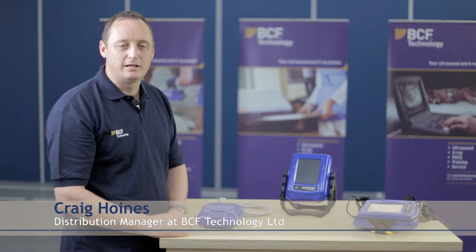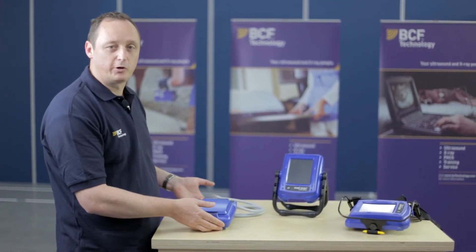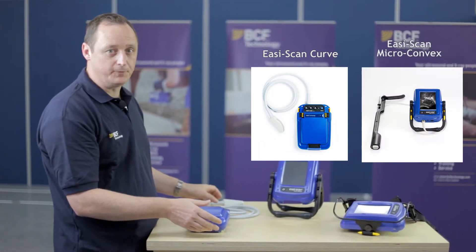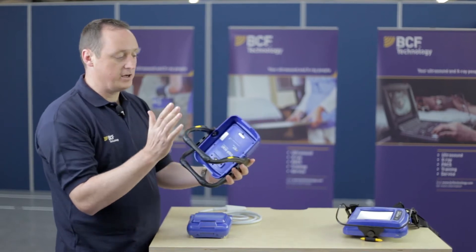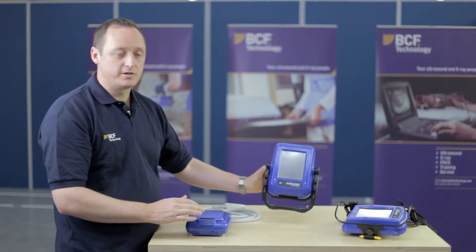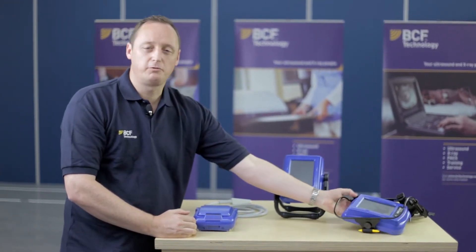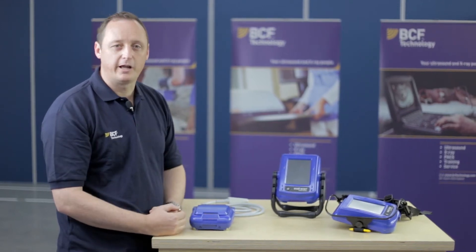Looking at the smart display and how this works together with the EasyScan. We have the EasyScan product, which could be the linear, the curve, or the micro-convex probe option. It works with the smart display and I'll show you how to attach the EasyScan to the back of the smart display. Then we'll look at the smart display harness version and go through each application, as they are different and have different applications.